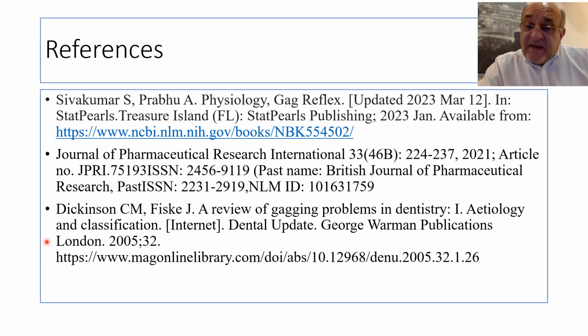With this, I would like to recap. Gagging is a natural reflex that can be aggravated by touching certain areas. A dentist, if being gentle and knowing the areas to avoid, I think dentists and their assistants can reduce, if not eliminate, the gagging reflex totally.